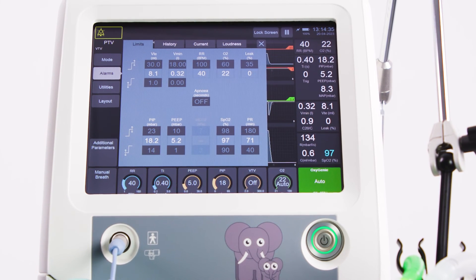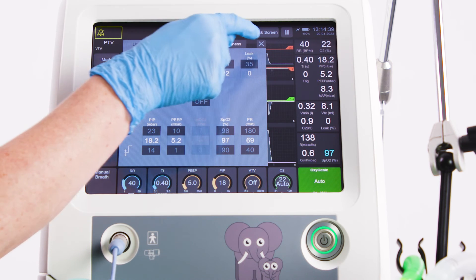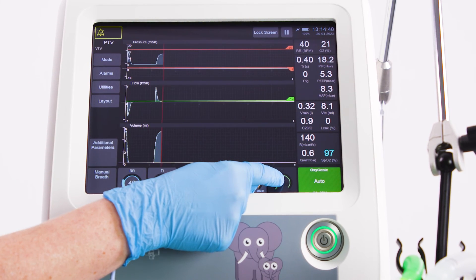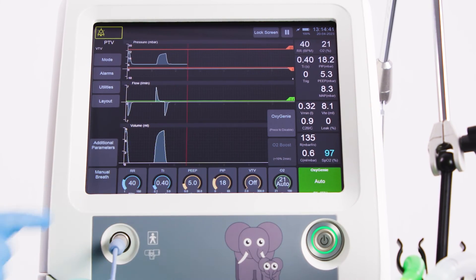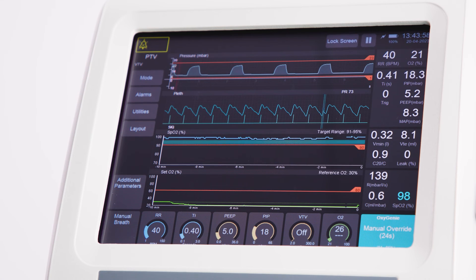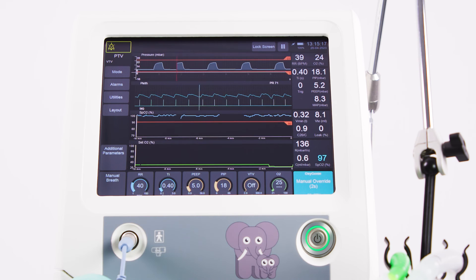At any time, the user can manually press the O2 control to override Oxygeni and set a manual O2 value, which counts down for 30 seconds. After 30 seconds, Oxygeni's automatic mode is re-established.